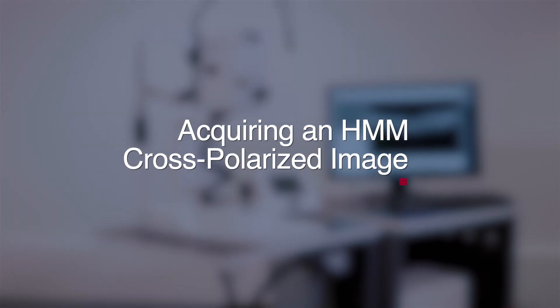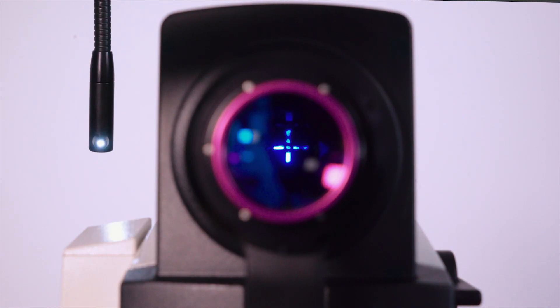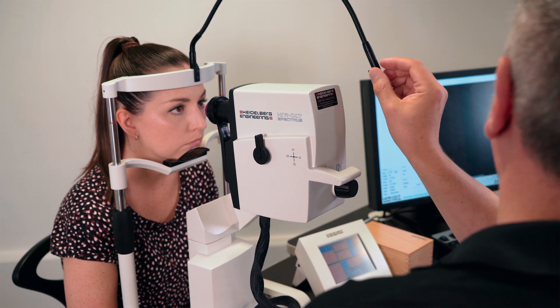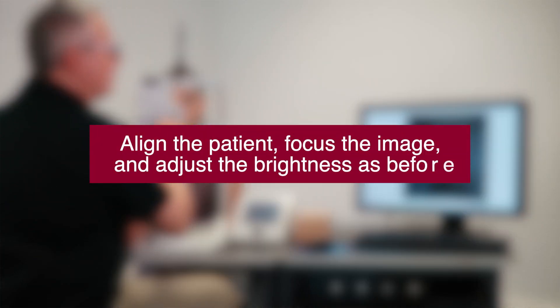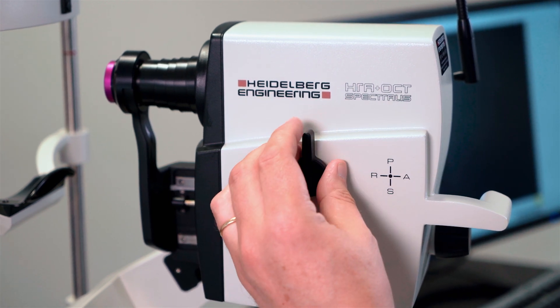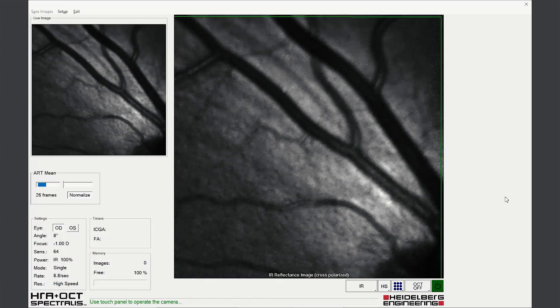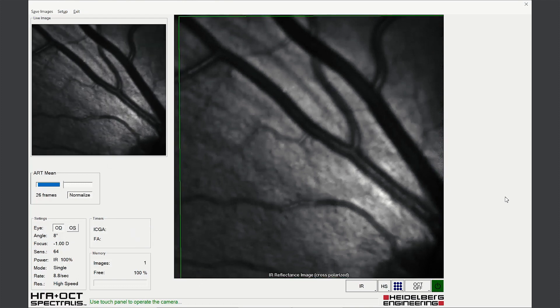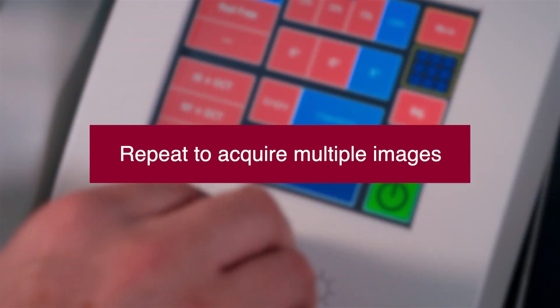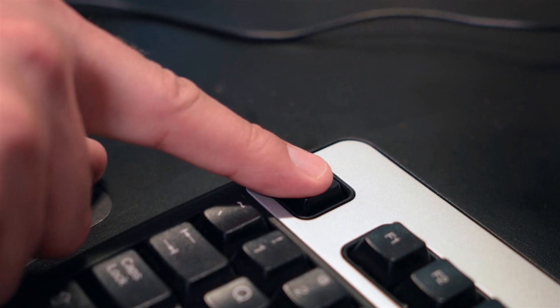Acquiring a cross polarized high magnification image. Select the external fixation target and adjust fundus position to visualize the retinal fiber layer. Align and position as before, select the cross polarized modality, and acquire images using eye tracking. It may be necessary to acquire multiple fundus images to document changes completely. Exit and save examination.